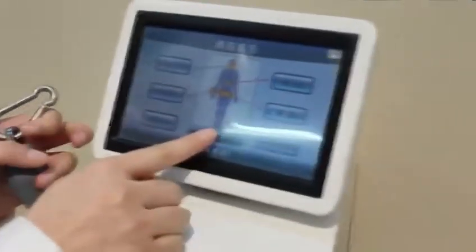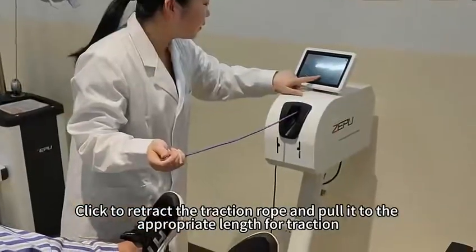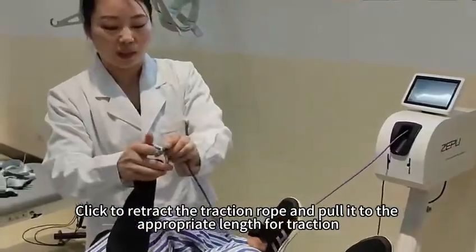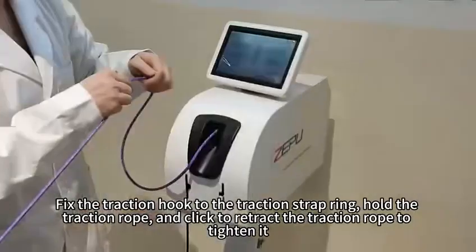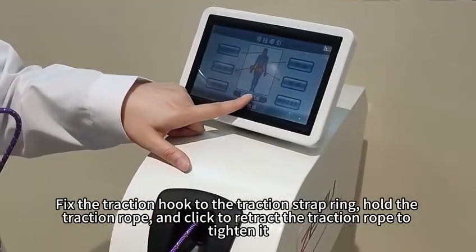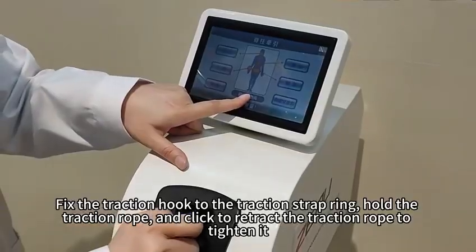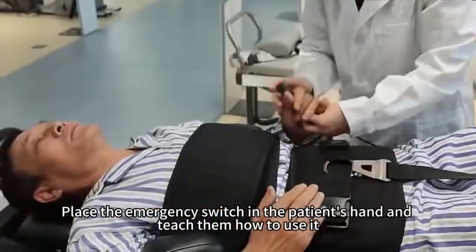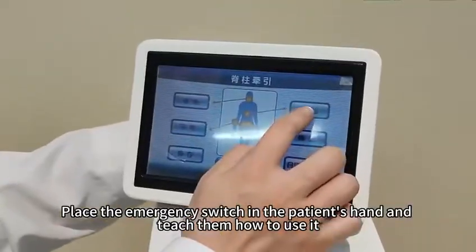Software operation. Click to retract the traction rope and pull it to the appropriate length for traction. Fix the traction hook to the traction strap ring. Hold the traction rope, and click to retract the traction rope to tighten it. Place the emergency switch in the patient's hand and teach them how to use it.